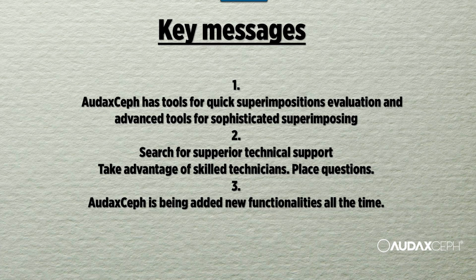Audax can and will help you also with experiences in, for example, structural superimpositions, because we collect the knowledge from everywhere when we are in contact with orthodontists, and we want to share this knowledge with you. The third thing, AudaxCeph is being developed all the time. New versions with cool functions will be available for your use.